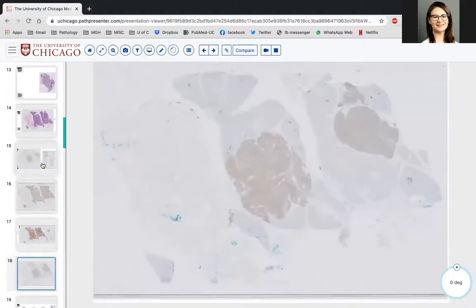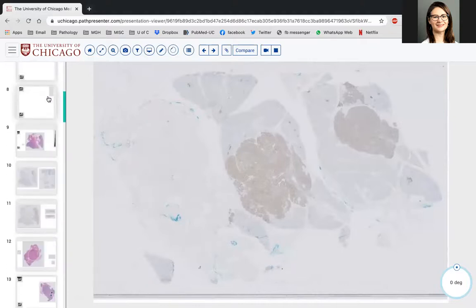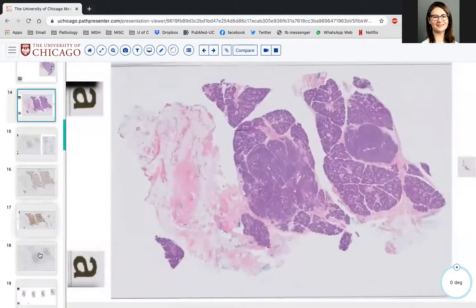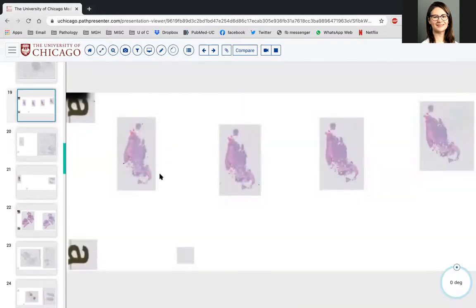The more cautious you can be on a core or on a frozen is to your advantage, with the caveat that we are able to distinguish high versus low grade, at least in most cases. And you don't ever have to stick your neck out if you don't feel comfortable. But if you do and you're wrong, it's okay. It happens. Questions or comments?